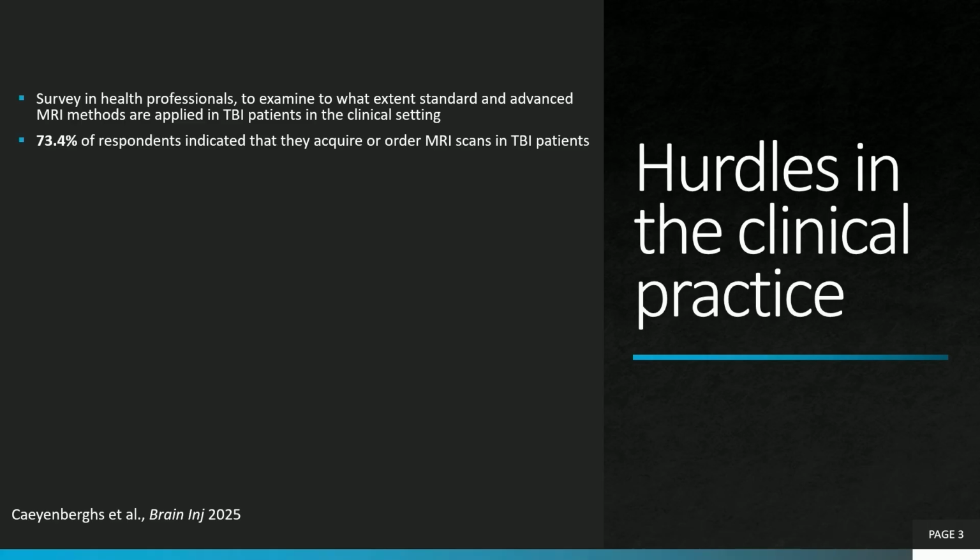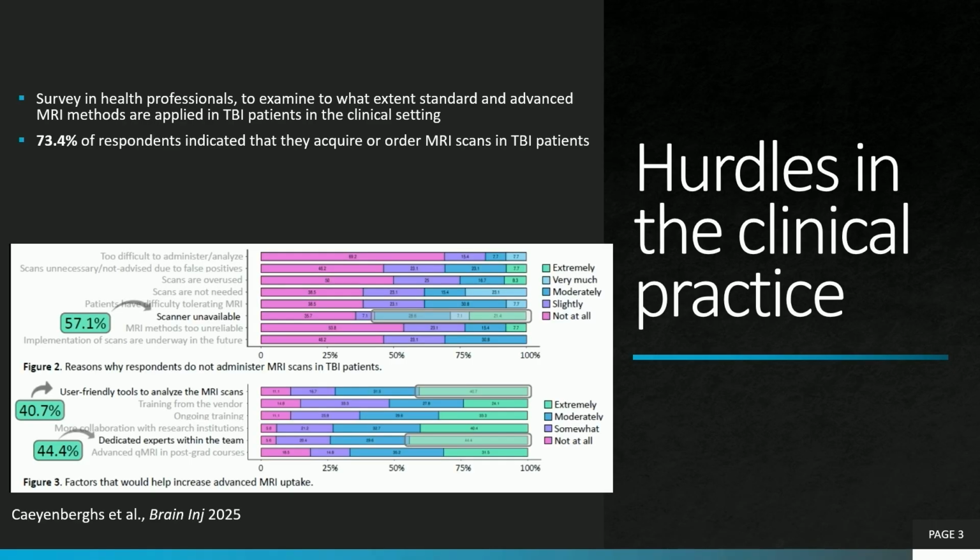First of all, there's some positive news. The majority of health professionals, 73%, indicated that they are acquiring MRI scans in TBI patients. However, there's still a quarter of health professionals that are not.